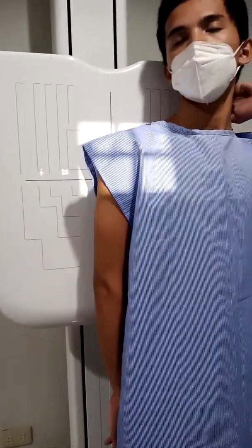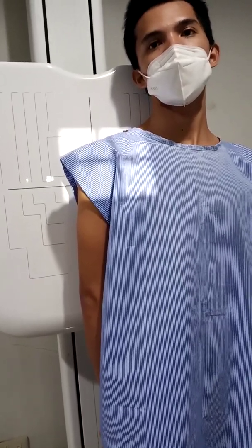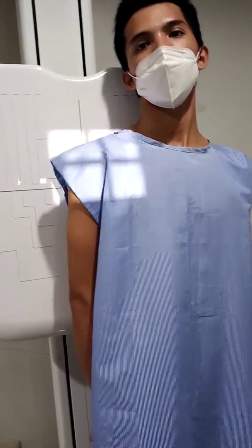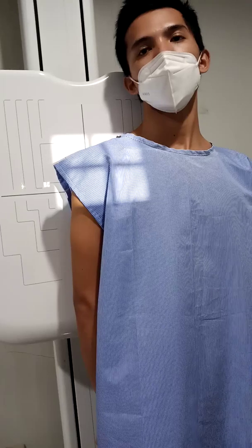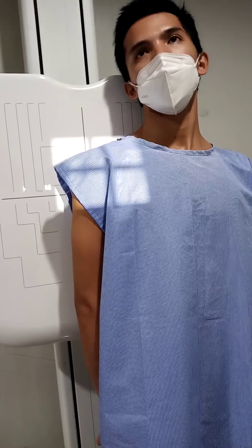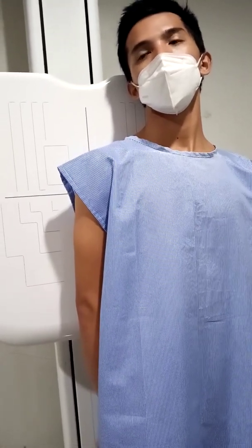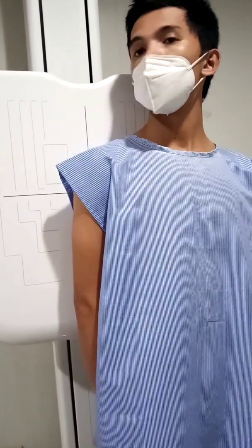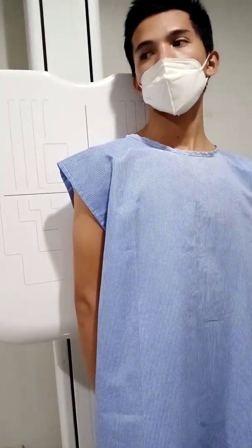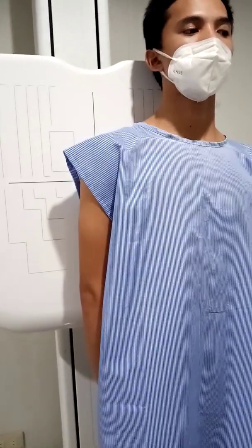Next one is the Grashey method. In Grashey's method, the cassette that we're going to use is 18 by 24 centimeter or 8 by 10 inches. So, in positioning, the patient must be in erect or supine position. Today, the patient is in the erect position. Then, instruct the patient in oblique 35 to 45 degrees toward the side of interest.